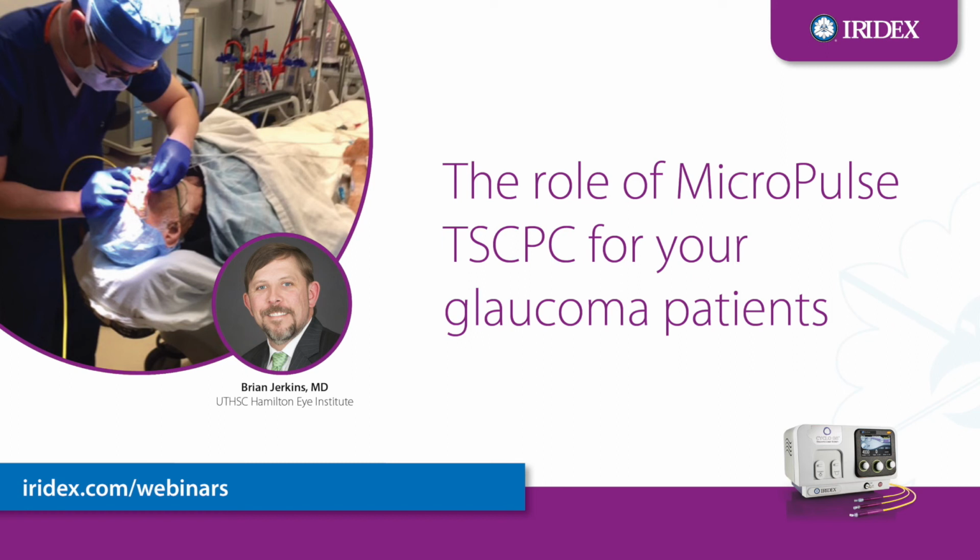If I could just add, if you are going to choose to do peribulbar or retrobulbar anesthesia, I think it's important, because I notice doctors finishing the anesthesia and then wanting to treat right away. It takes 15, 20 minutes for that anesthesia to take. So if you deliver it and then try to treat right after, you're going to have a very uncomfortable patient. So it's important to give them the time for that anesthesia to take prior to you trying to deliver the energy. Oh, I completely understand.